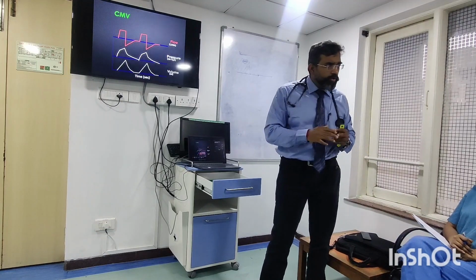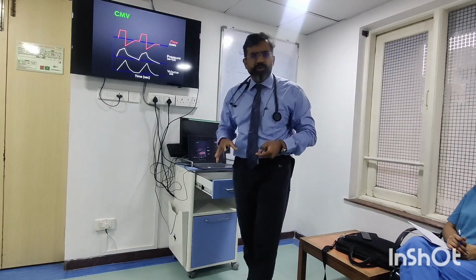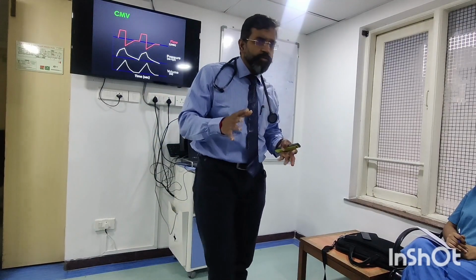Now I'm going to tell you about trigger, I'm going to tell you about limit, I'm going to tell you about cycle. These waveforms may not look like this on the ventilator, they are different. But this is a basic understanding of what the waveforms are all about.